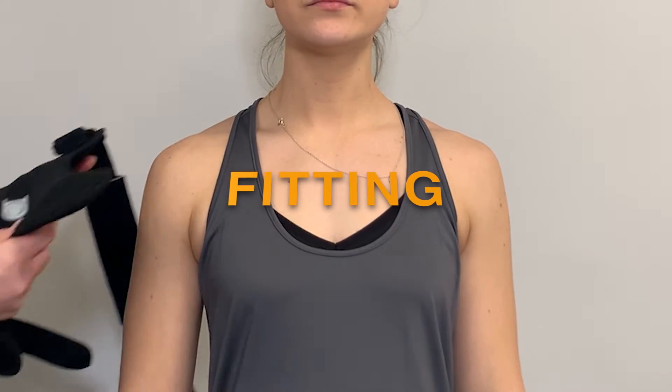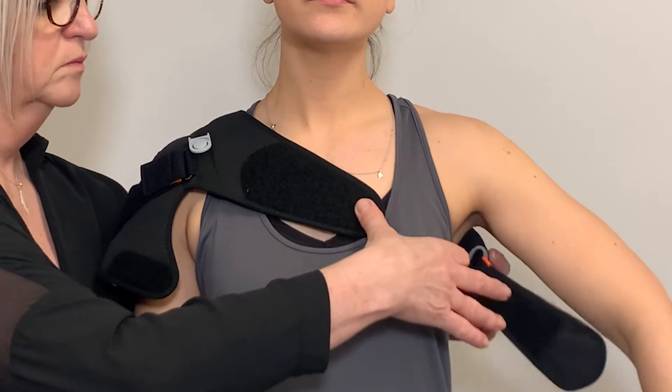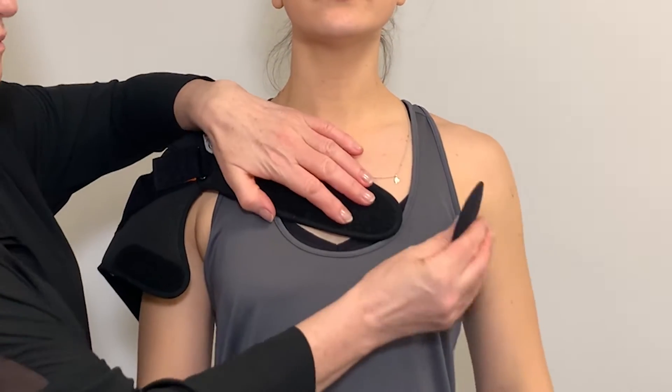To fit the brace, first apply the shoulder element and close the chest strap and the hook and loop strap on the upper arm.